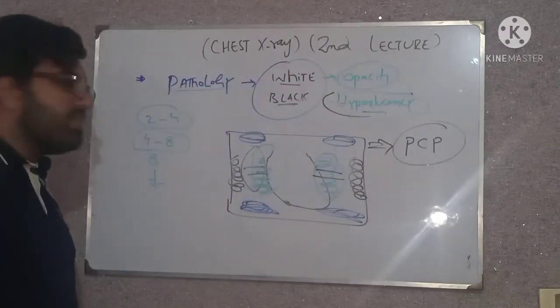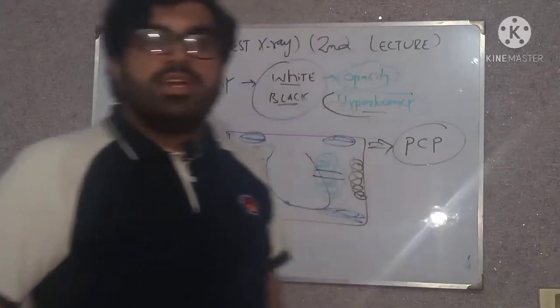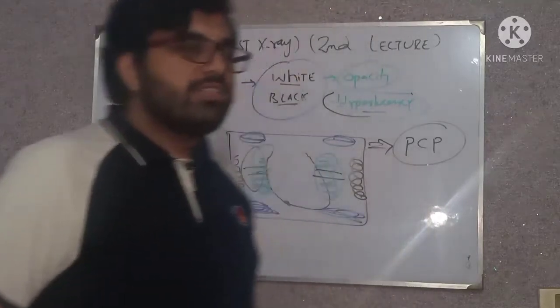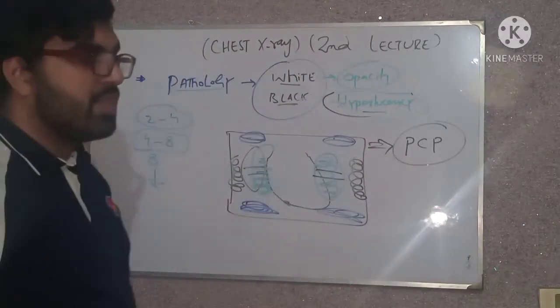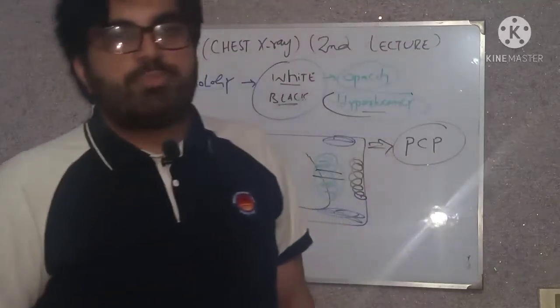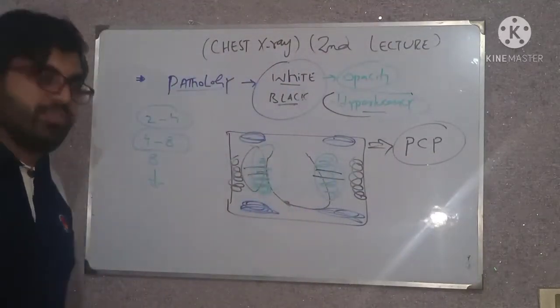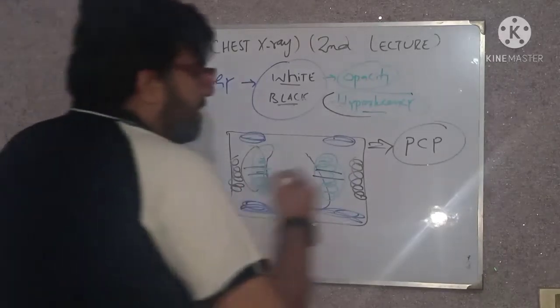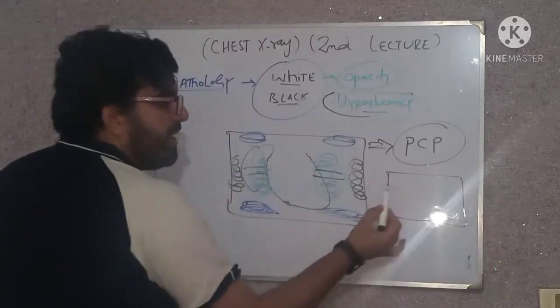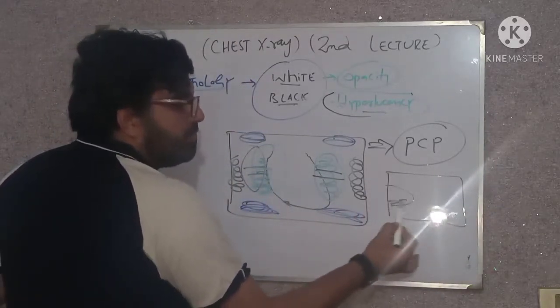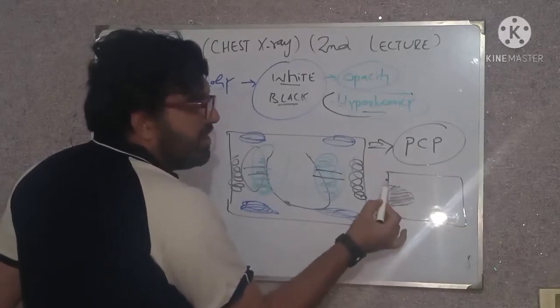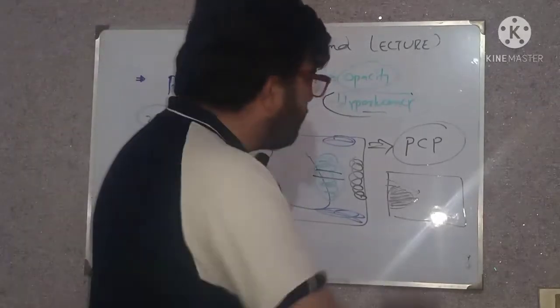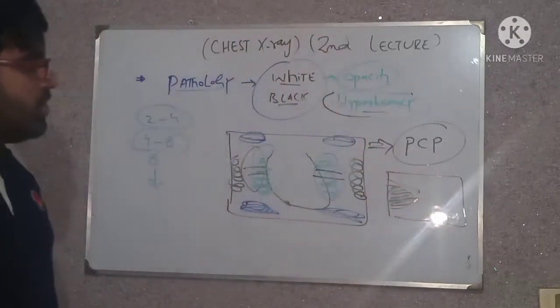A 23-year-old young female, married for five years, on OCP, presented to the ER with chest pain and oxygen saturation of 86%. On chest X-ray there is a pleural-based opacity on the right, in the middle zone, extending from periphery toward the center forming a wedge shape — the diagnosis is pulmonary embolism.